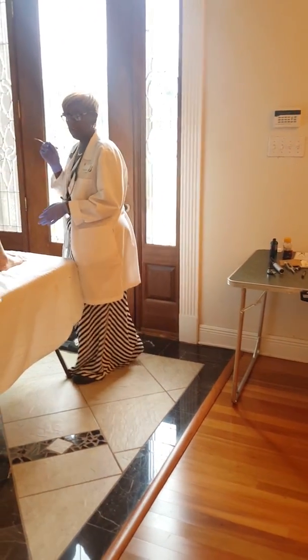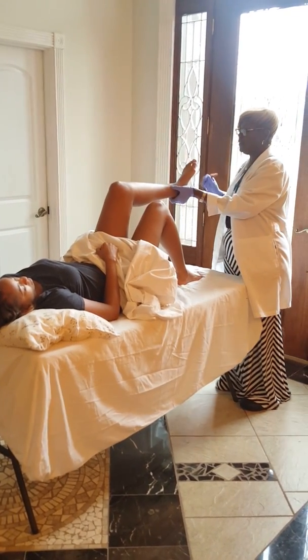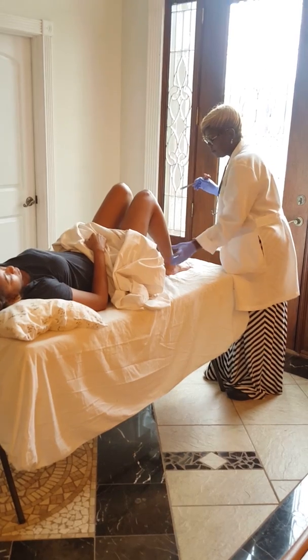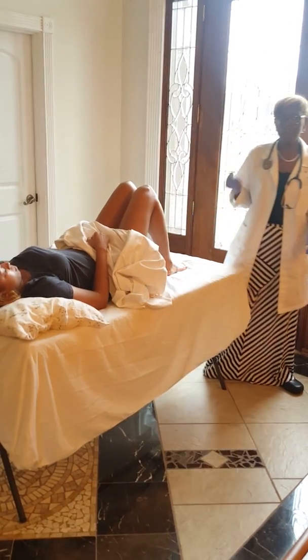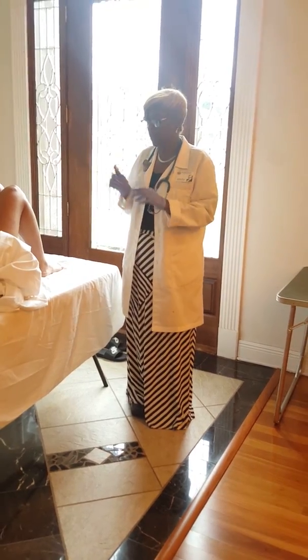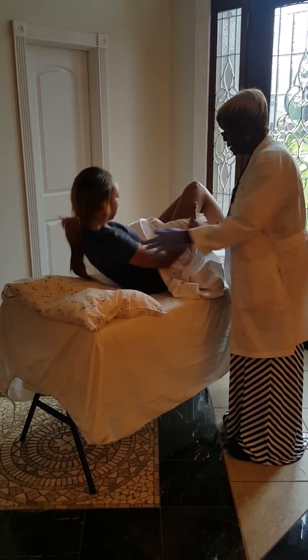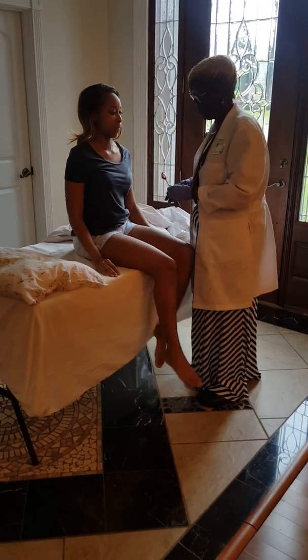While we're doing that, let's check the Babinski. In the Babinski, we use our little hammer and we check for her Babinski. Okay, in an adult, your toe should point downwards, so her Babinski is good, within normal limit. And it's also within normal limit in the other foot. If we were assessing a child, her toes should swing upward. That's a positive Babinski, which is only normal with a child. So for this part, we're gonna ask Ms. Smith to sit up for me, and we're gonna check her reflexes.